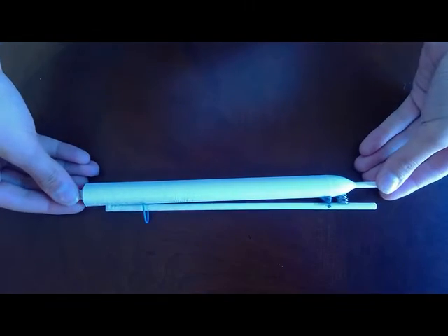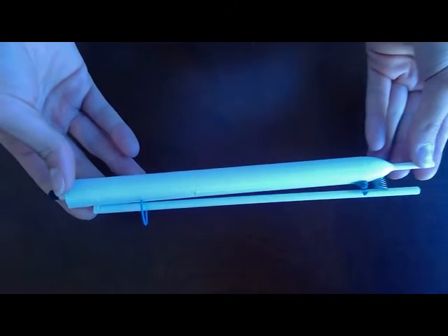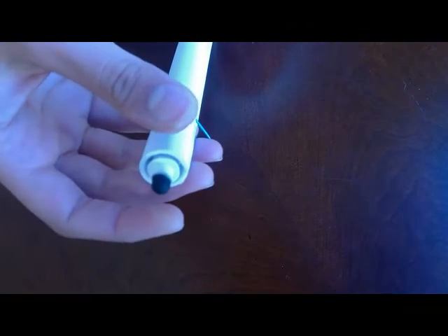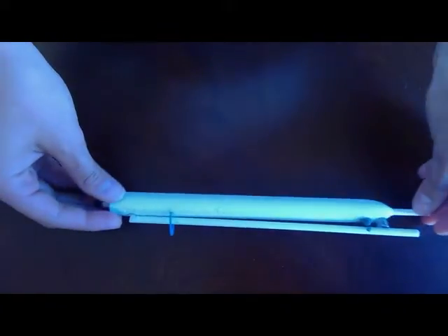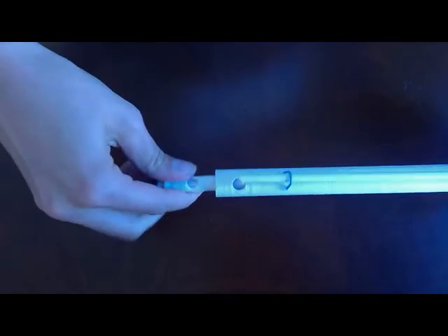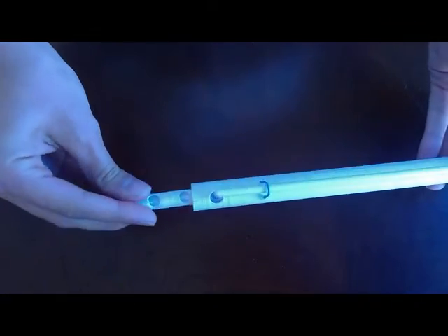A few adjustments can be made to improve upon this mouthpiece design. The first would be to reduce its weight as it is slightly heavy to be held for long periods of time by a patient in their mouth. This can potentially be accomplished by reducing the diameter of the outer tube and the inner tube. We could also create a new sliding mechanism for the inner tube as it could potentially twist and keep the clip from locking properly into place.